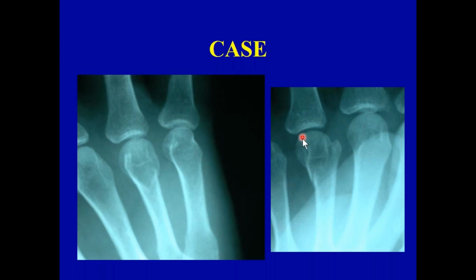So in certain situations, if your doctor is worried about a fracture and he sends the films to us and I ask for a semi-supinated view and you don't remember what that is, just call us, email us, and we'll send the exact instructions on how to perform this semi-supinated view. Then I can in turn around to the doctor and I can say, yes, there's a fracture, and that fracture needs the intervention of an orthopedist, preferably a hand specialist.